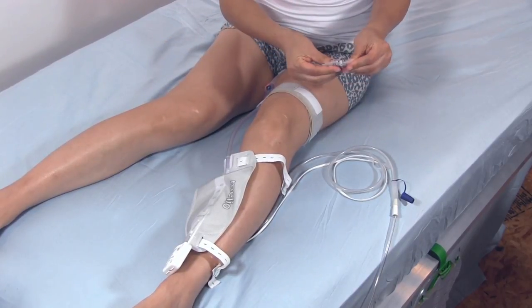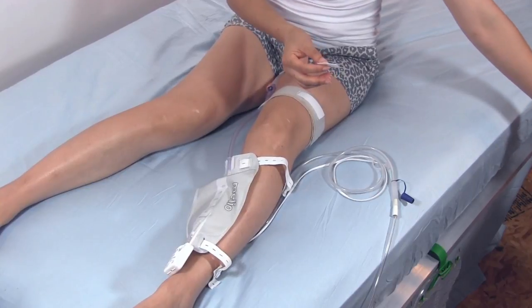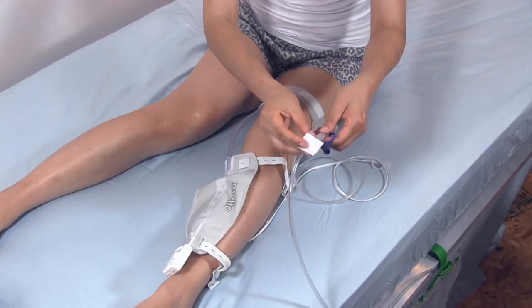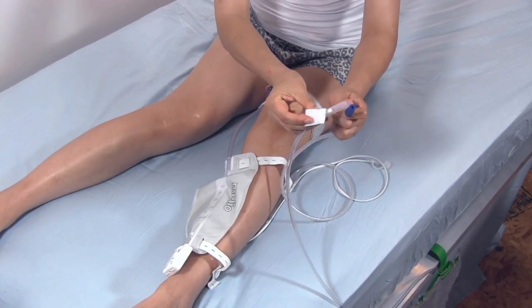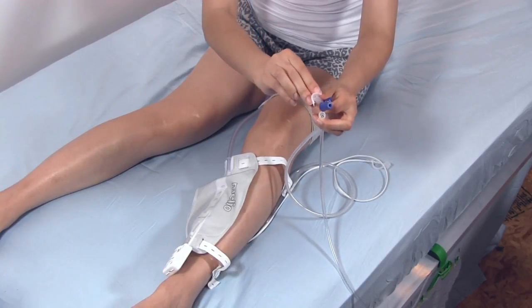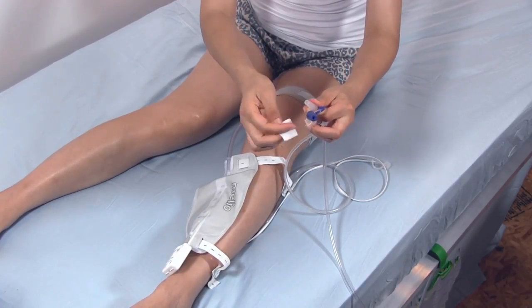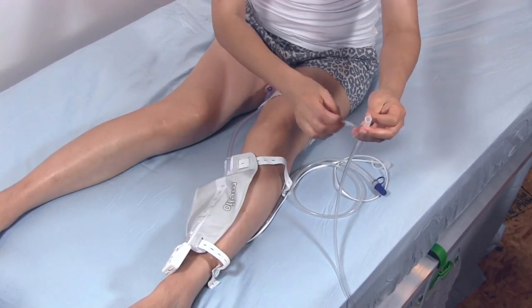In the morning, simply disconnect the discharge tube from the night bag. Then clean the end with an alcohol wipe and replace the end cap. Empty and care for your night bag as directed.